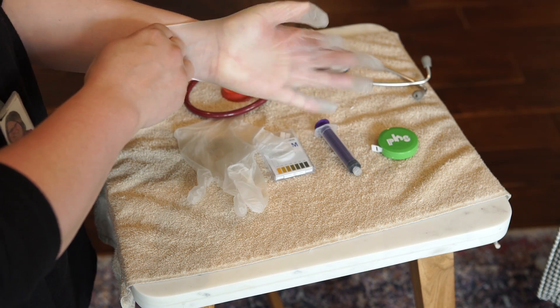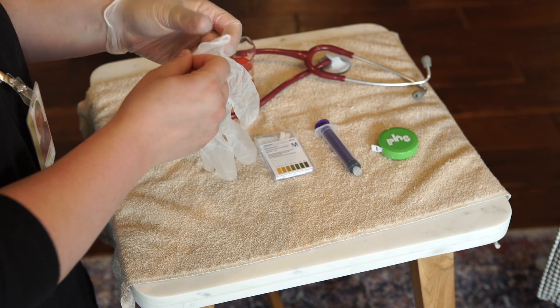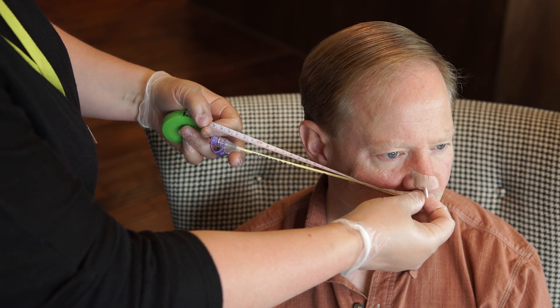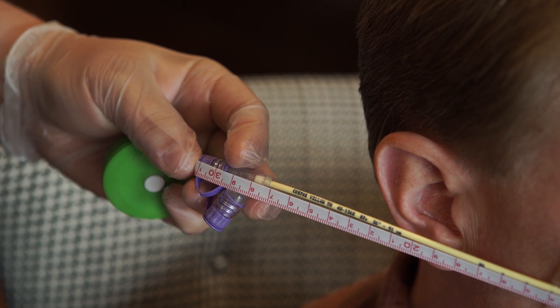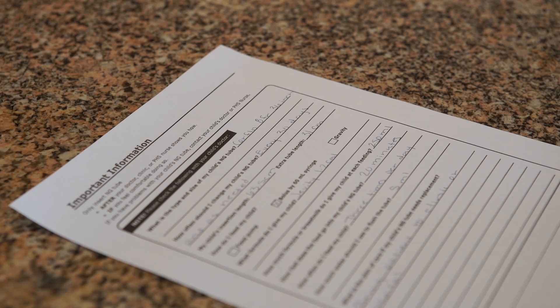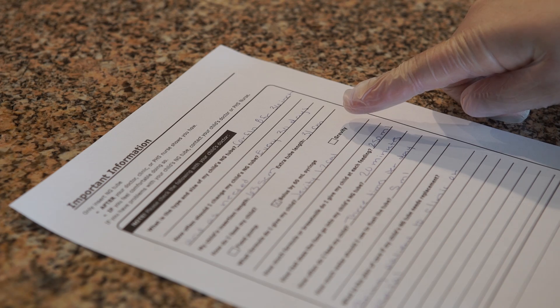Put on the non-sterile gloves. Measure the external tube length — this measurement starts where the tube exits the nose and runs to the end of the feeding tube. Compare this measurement to the external tube length recorded at the time of insertion.